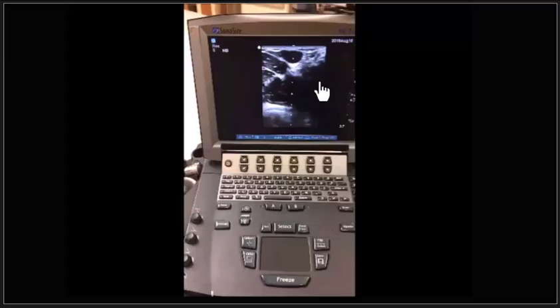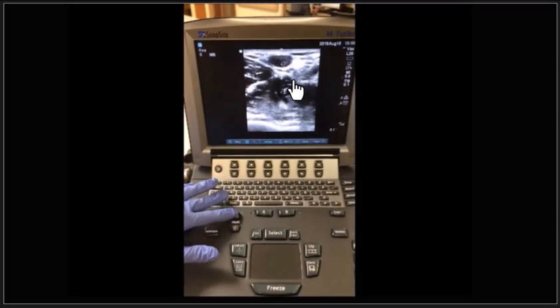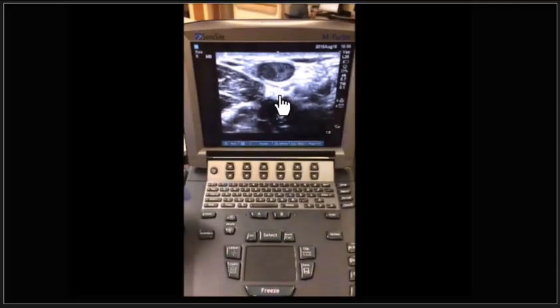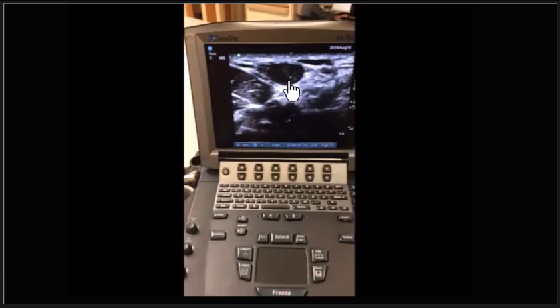So here we have our vessel on our ultrasound screen. What is a way that you can make that vessel appear more ideal? Well, it looks to be very superficial. So one thing we would want to do is change the depth. Here we have that vessel. We're changing the gain. We're altering the depth to make it more towards the midfield. And then look how you can change the brights or darks to make sure that that vessel is appropriately anechoic. And again, as we mentioned before, we want the blood vessel on the center of the ultrasound screen.